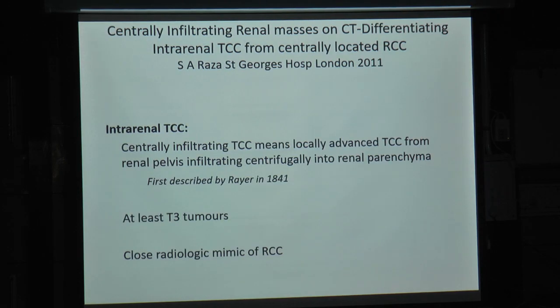This is a paper pulled up from, this is actually a multi-center study, but the paper was published by Raja from St. George's, London. Now, what they did, they collected a few CT scans over 3 university hospitals, over a period of 6 months, 1 year, something like that.